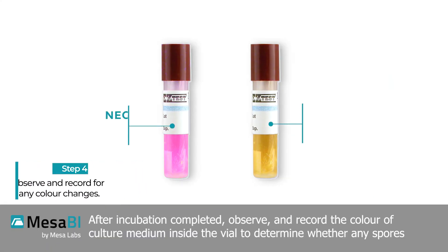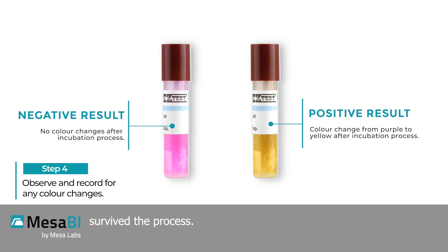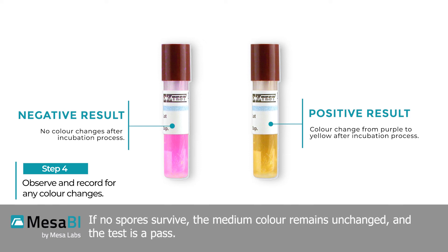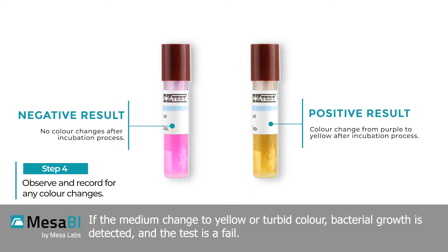After incubation is completed, observe and record the color of the culture medium inside the vial to determine whether any spores survived the process. If no spores survive, the medium color remains unchanged and the test is a pass. If the medium changes to yellow or turbid color, bacterial growth is detected and the test is a fail.